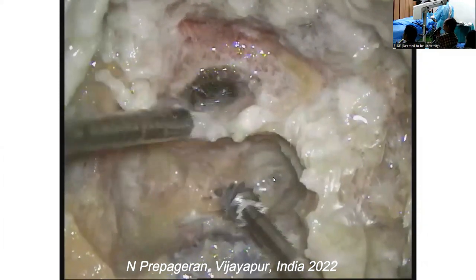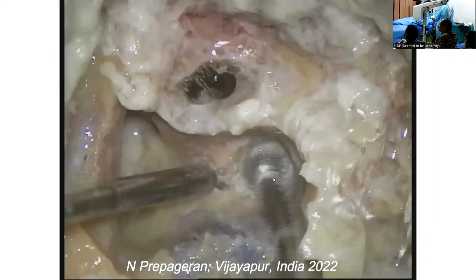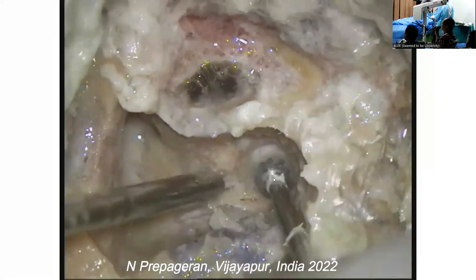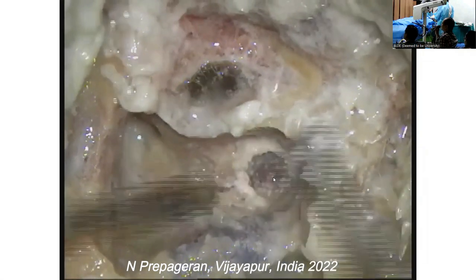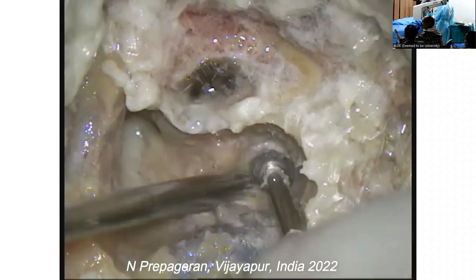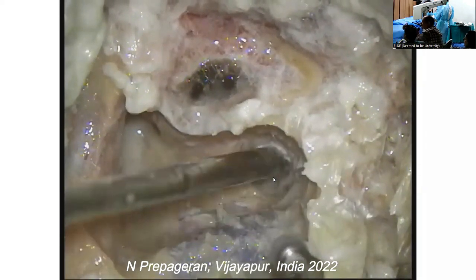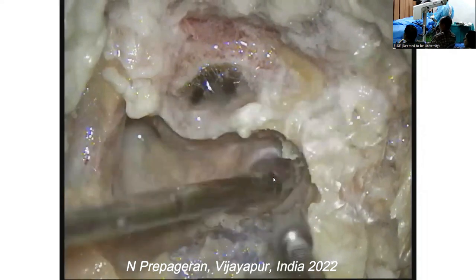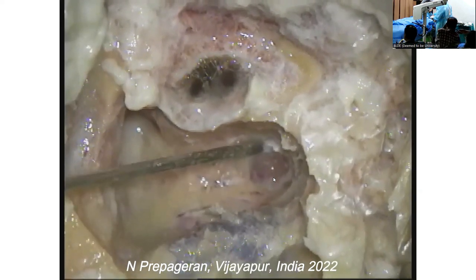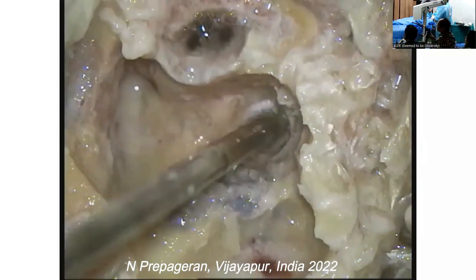So now, I want to find the jugular bulb. So by right, I'm supposed to use that, guys. See, jugular bulb coming to view. Can you see? Yes, sir. The jugular bulb. Water. Can you see the jugular bulb there? Yes. That's the facial nerve and jugular bulb down there. Can you see the facial nerve? It's the digastric tendon. This is the facial nerve, and behind that is the jugular bulb.